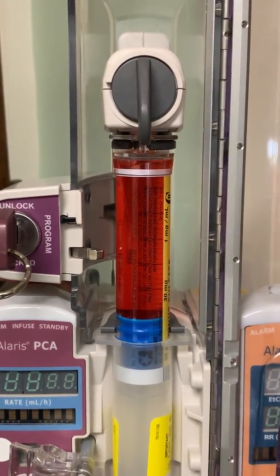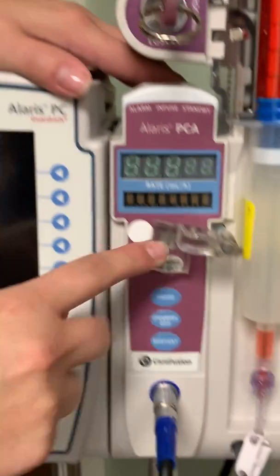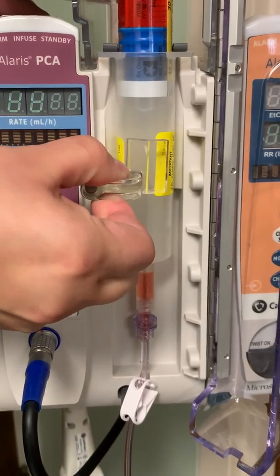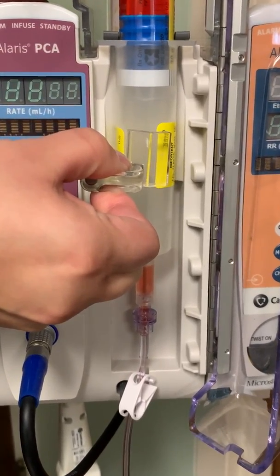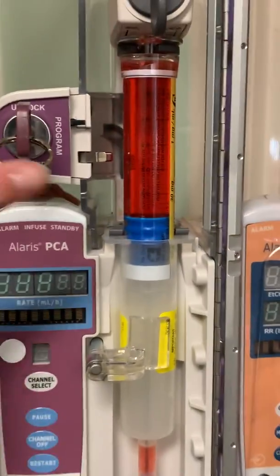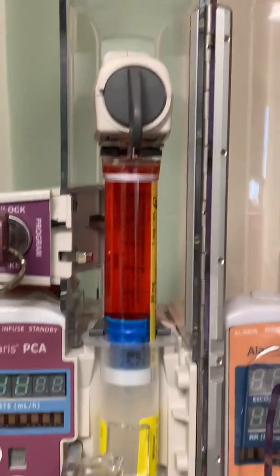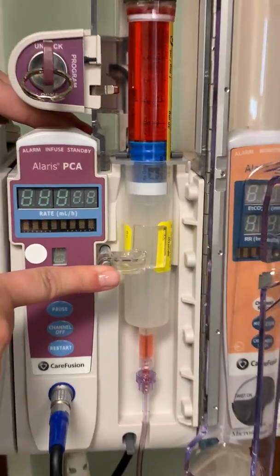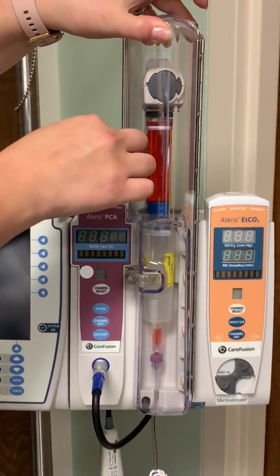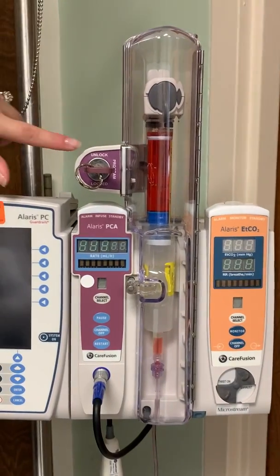And lastly, you're going to take the clear plastic syringe barrel clamp, pull it straight out, then turn it, rotate it so it sits right on the syringe barrel. So first is that middle part, then the top, then the little clear thing. That's the order of it. Then you can lock the door and you leave the key in for now.